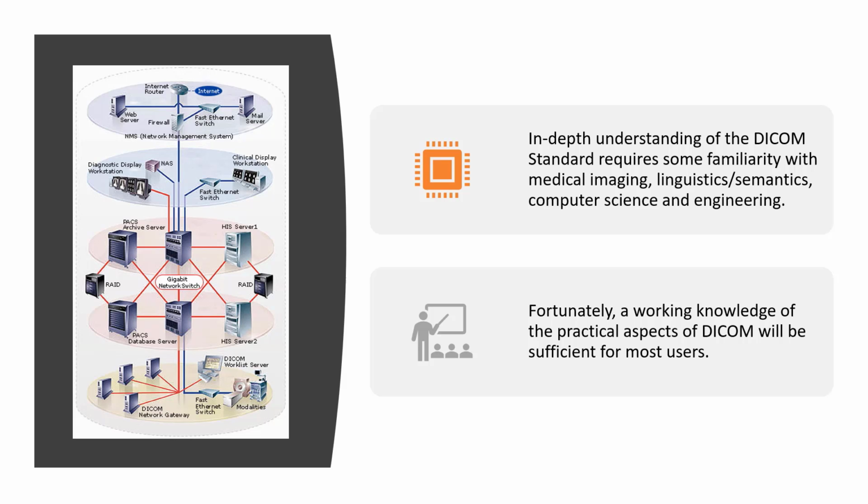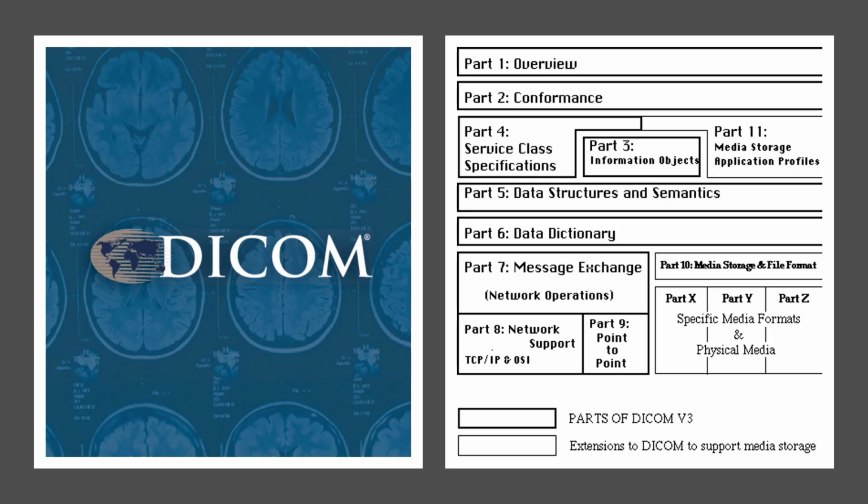In-depth understanding of the DICOM standard requires some familiarity with medical imaging, linguistics and semantics, computer science, and engineering. Fortunately, a working knowledge of the practical aspects of DICOM should be sufficient for most users. For many years, the DICOM version standard 3.0 was considered the correct standard for DICOM usage.